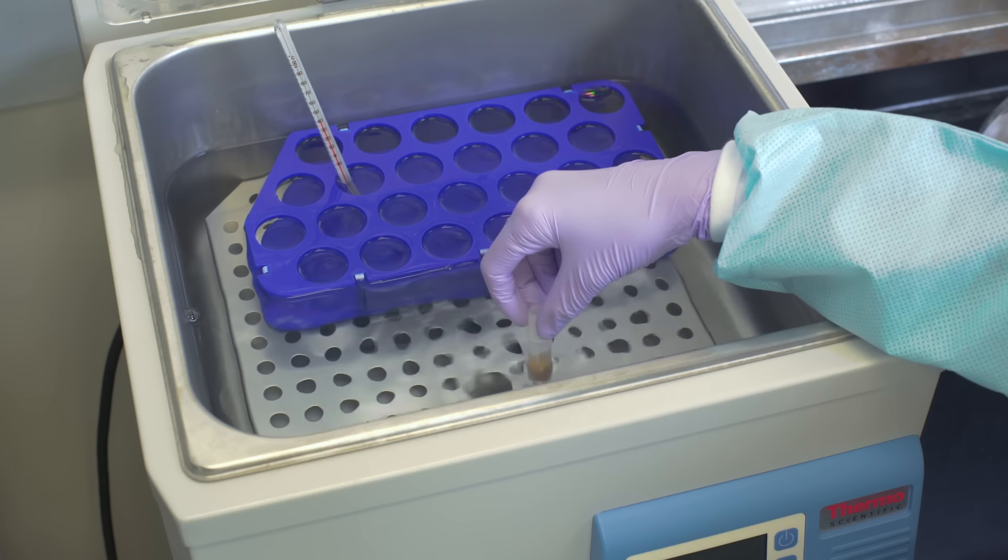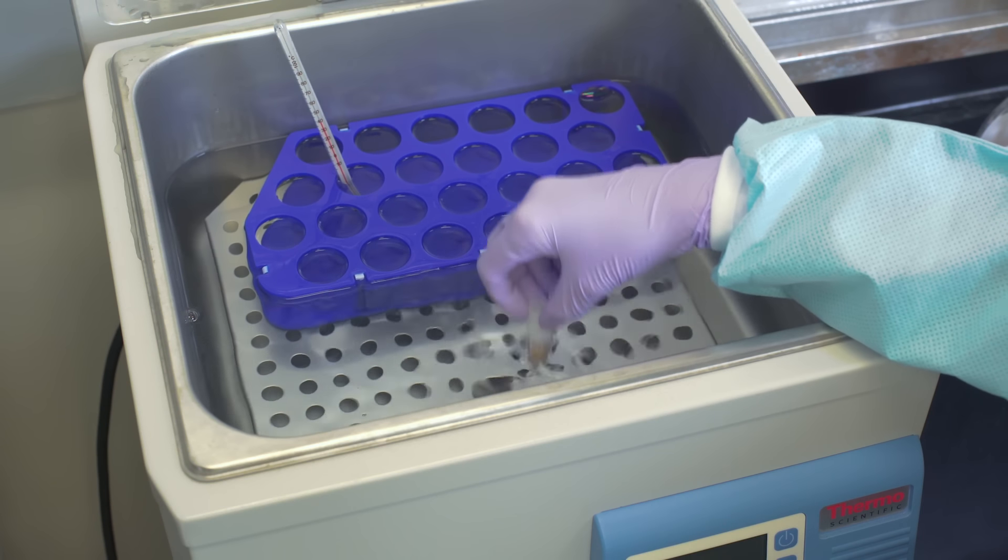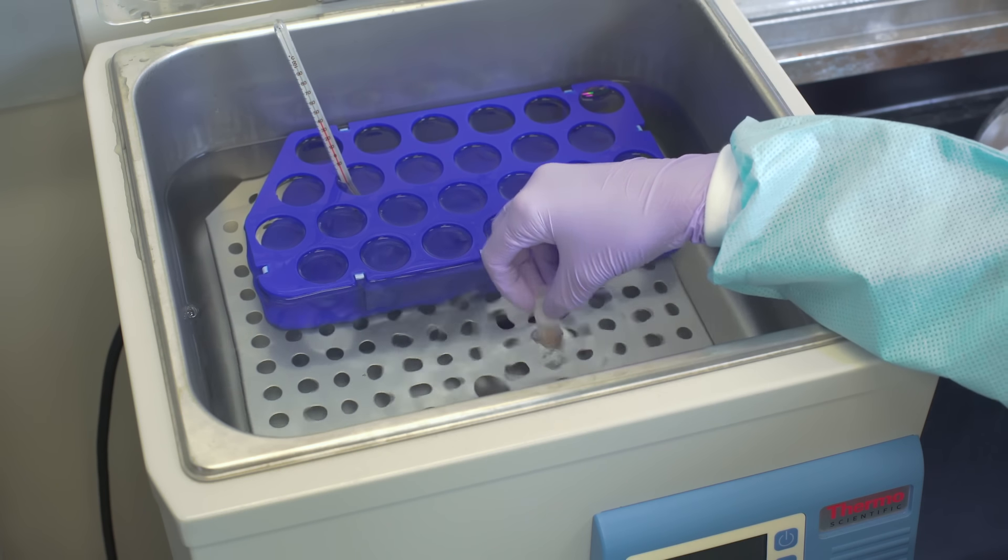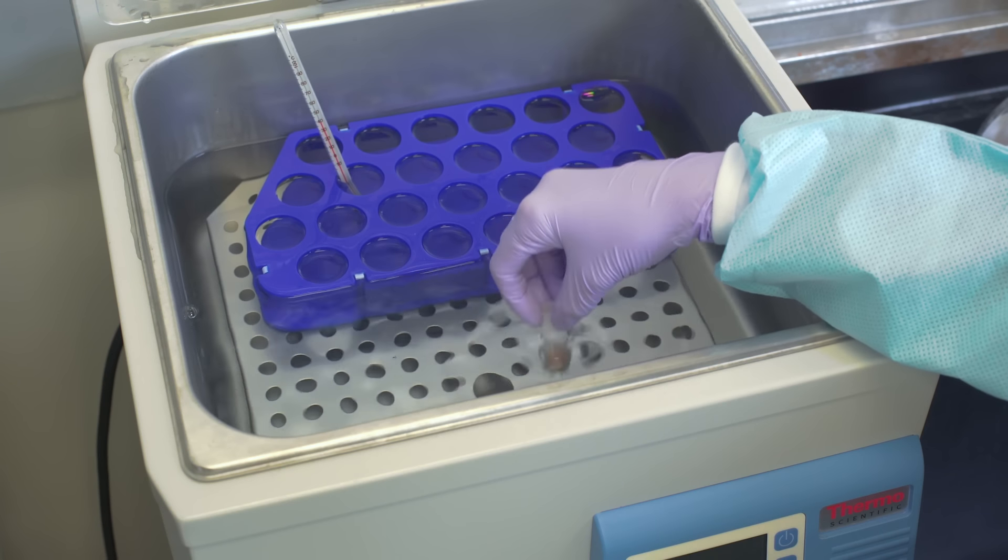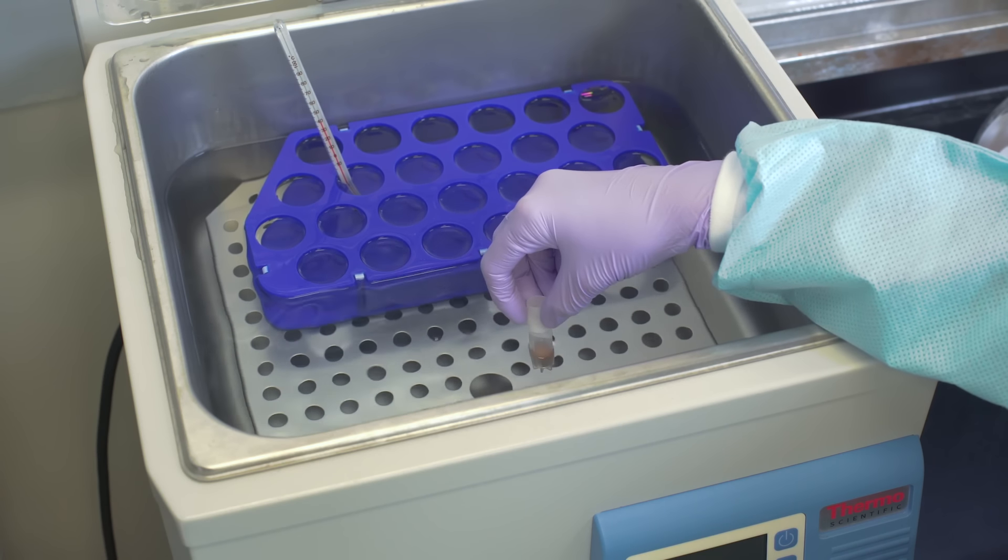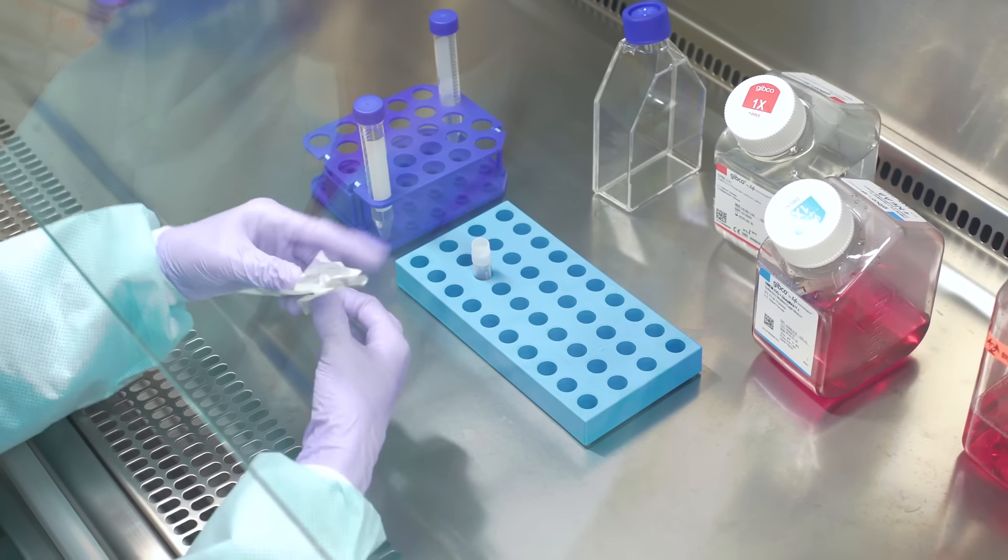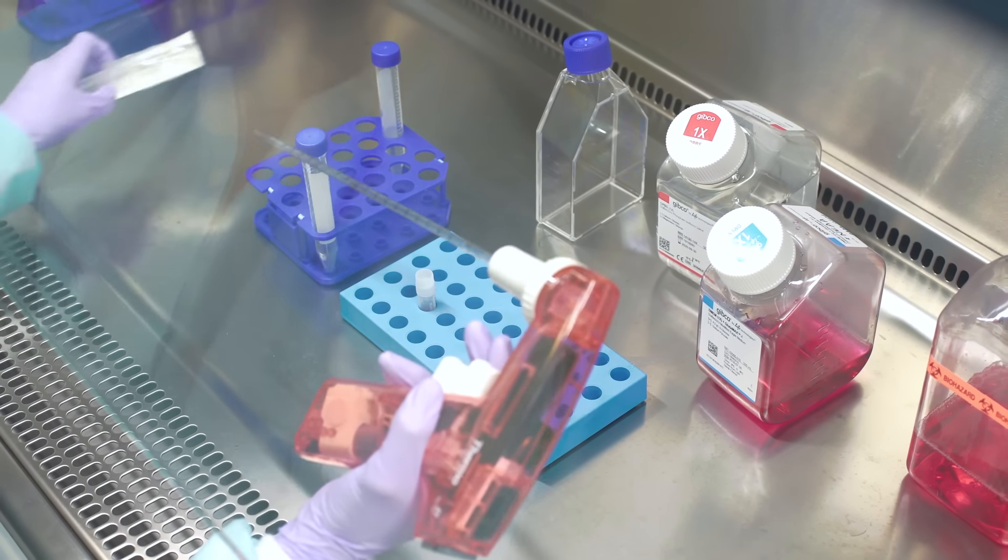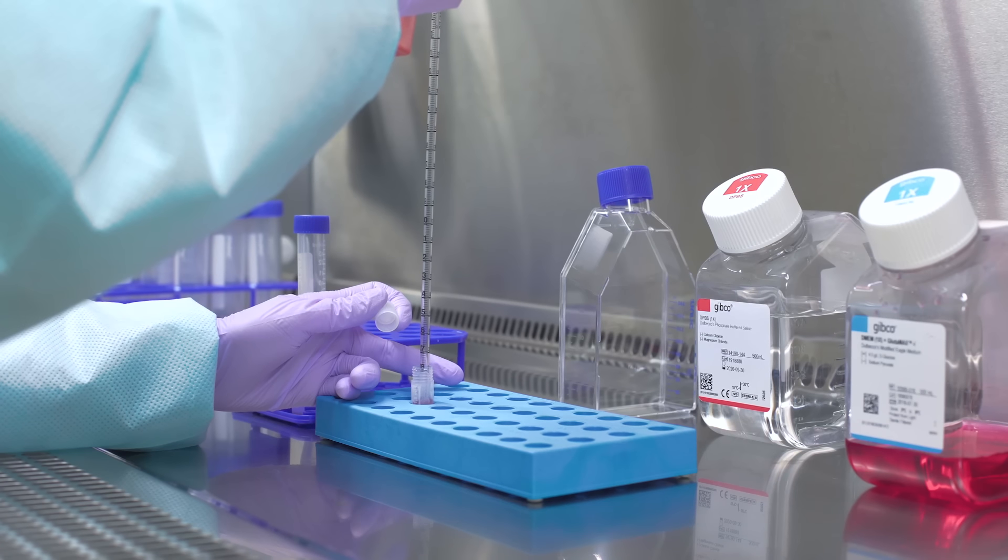The vial of cells should be thawed in a 37 degrees Celsius water bath quickly. Be careful not to submerge the vial as this increases the risk for contamination. Remove the vial from the water bath when a small chunk of ice remains inside. The ice chunk will melt as you move it to the cell culture hood. Wipe the vial with ethanol before placing it in the hood.